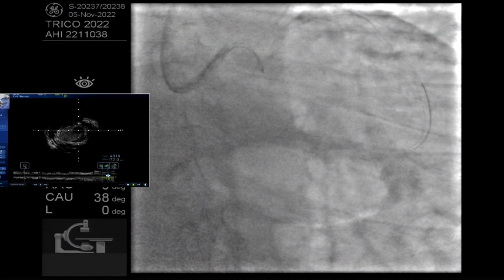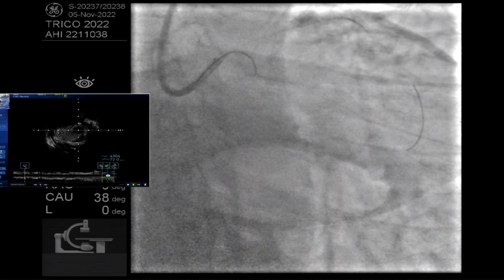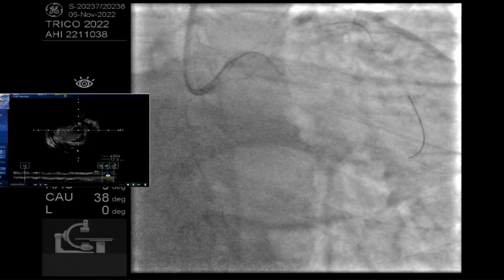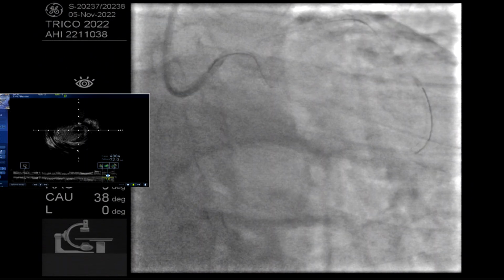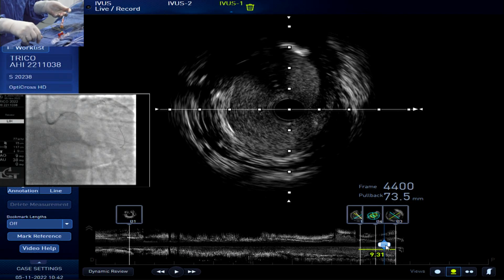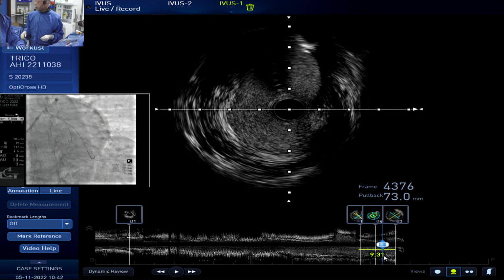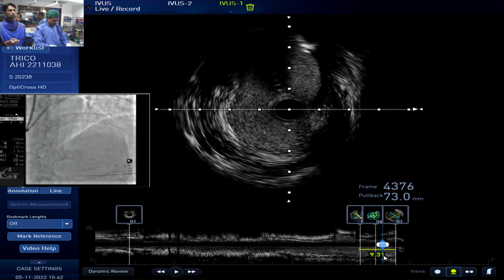But anyway, here, just distal to the ostium of the CX branch, it might be very difficult to put a stent. So it might be better to cross over, right? Crossover should be ideal, right? Here is the left main, and here also the left main distal, some disease you can identify, right? Okay. So the answer is very clear. We have to go for left main to LAD stenting. Yes, yes.